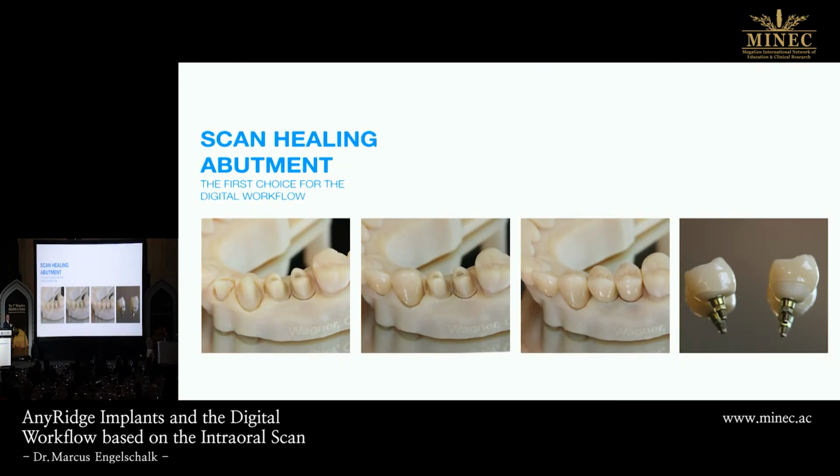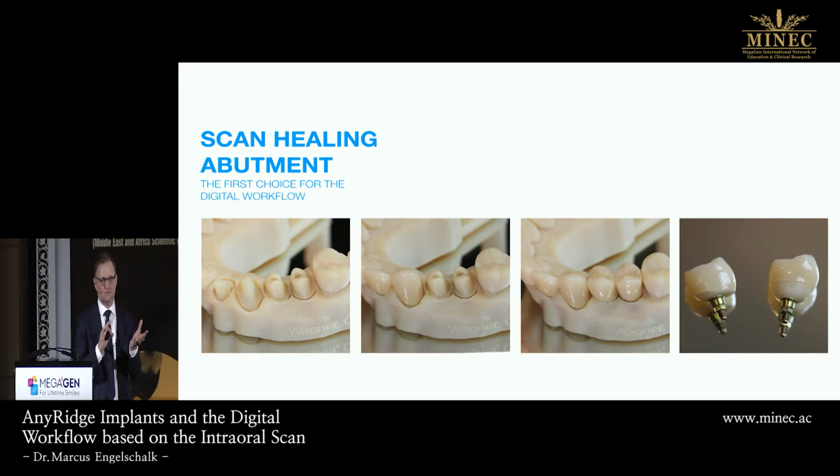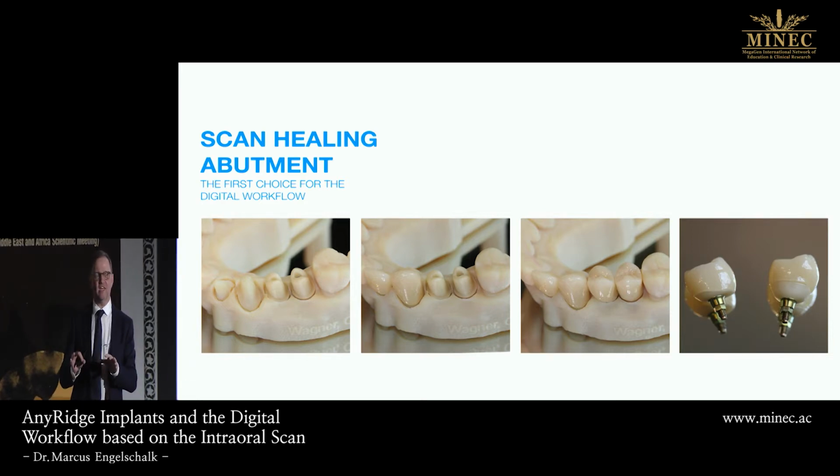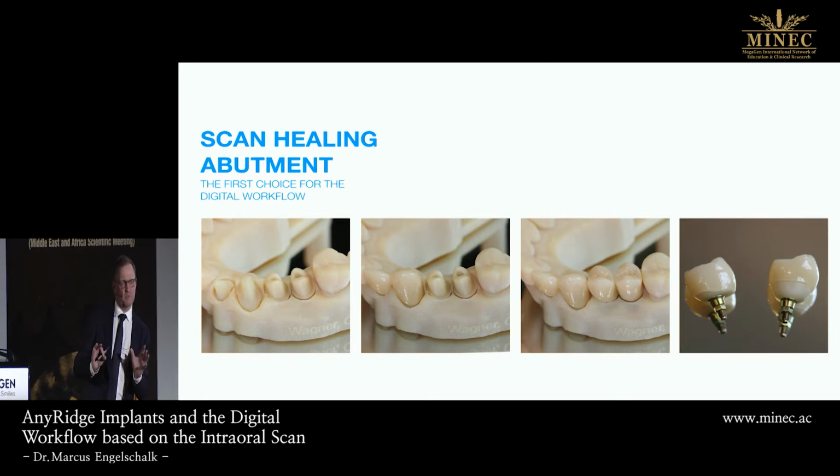It's another milling factory for models. Just want to show you some varieties. This is a tooth, this is a tooth, this is an implant, this is an implant. You can combine these things. And this is the first case where you say, well, doing this without any model, you can do it, but it will be critical.